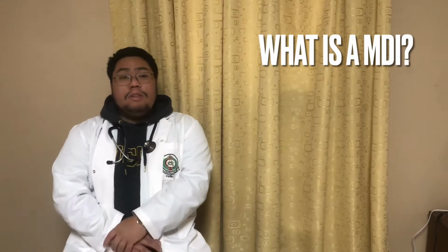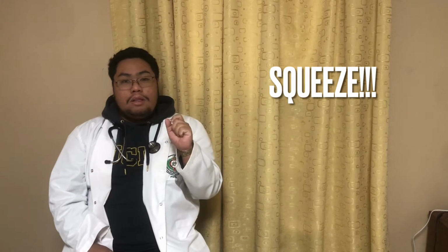An MDI, or a metered dose inhaler, is a small portable aerosol dispensing device which is hand operated and is powered by a propellant called HFA, much like an aerosol spray can. Each activation gives a certain dose of medication. After that, the patient must squeeze it with proper technique in order for the propellant to go inside the patient's mouth through to the lungs.